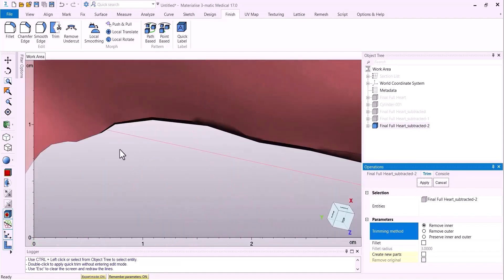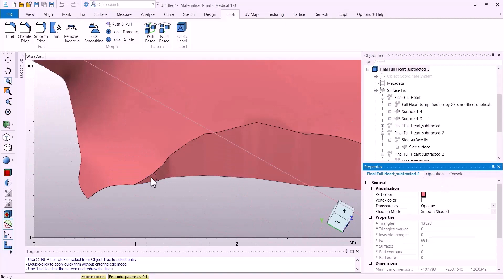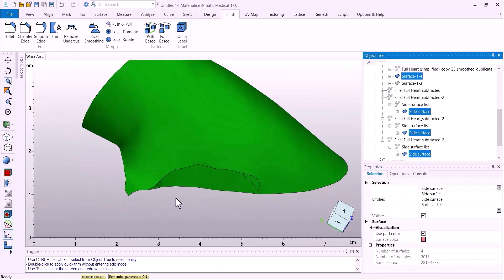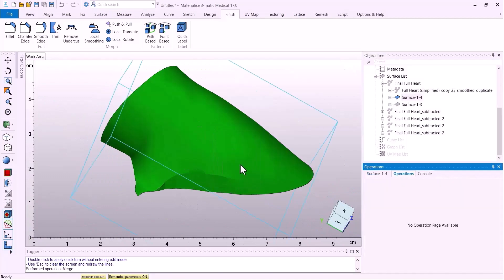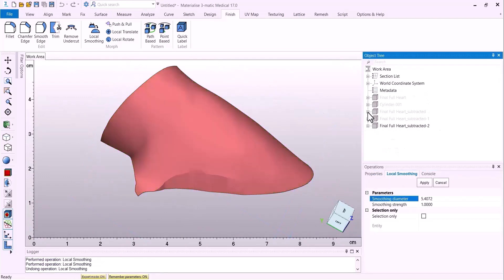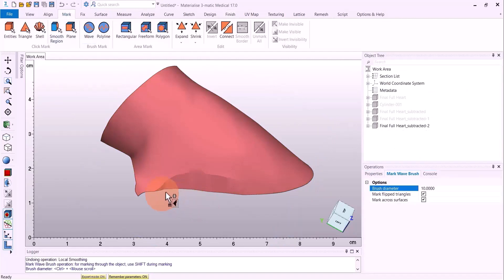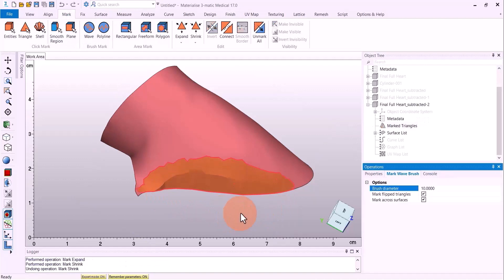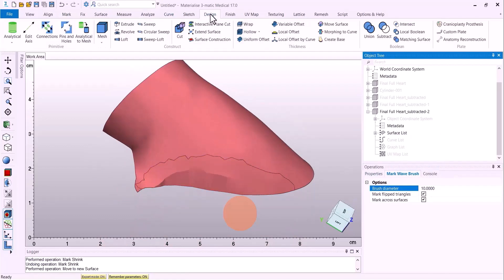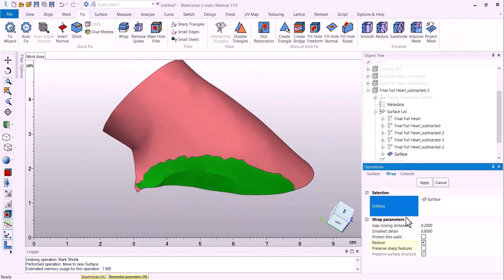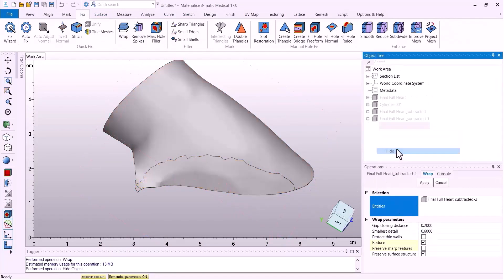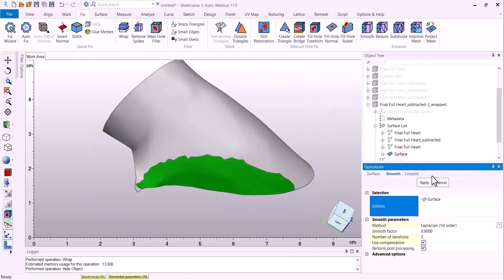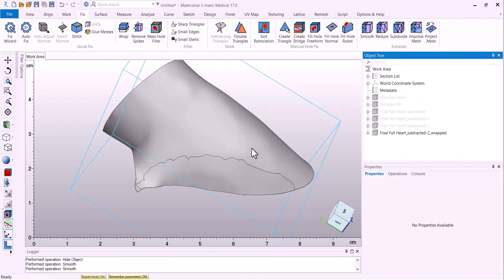And once you've made your cut, feel free to smooth it out. Do whatever type of modifications you need to make it a nice clean surface at the end of the day. You can even use the mark tool to mark an area and only wrap that one marked region. So here we will do a wrap as well as a smooth in order to get our surface nice and clean before we merge it back onto the model.